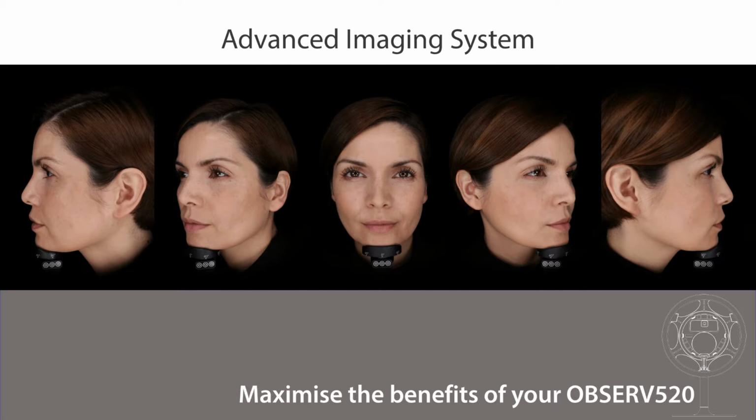The different side views, in addition to the frontal views, do not only allow you to create a global overview of the skin, but also allow you to accurately capture what is not always visible in the frontal view.